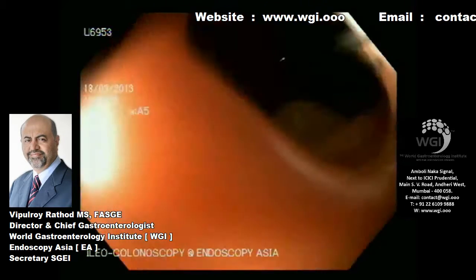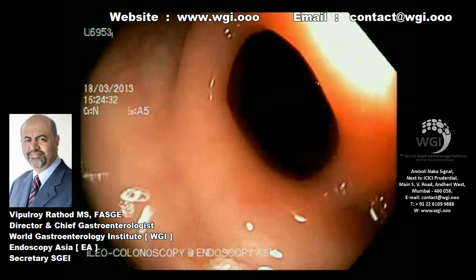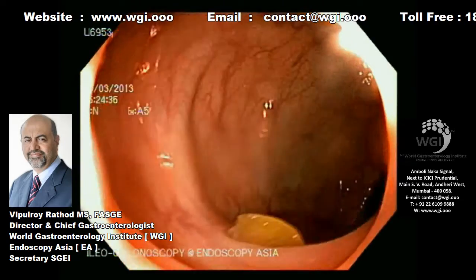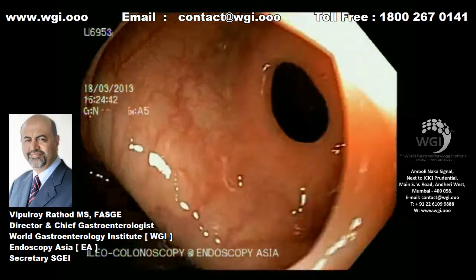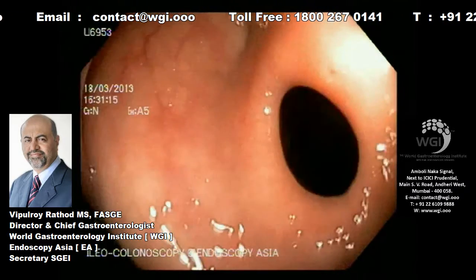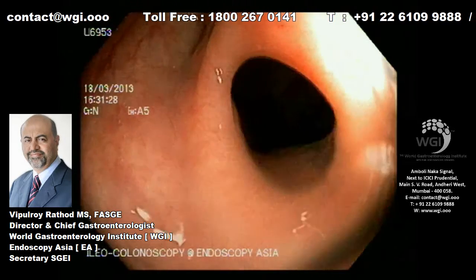We've entered the sigmoid colon, where there is an appearance of a very benign picture at the sigmoid junction. We are unable to pass the scope through this narrowed lesion, and there's no obvious significant disease surrounding this, and no significant pathology suggesting a neoplastic process.